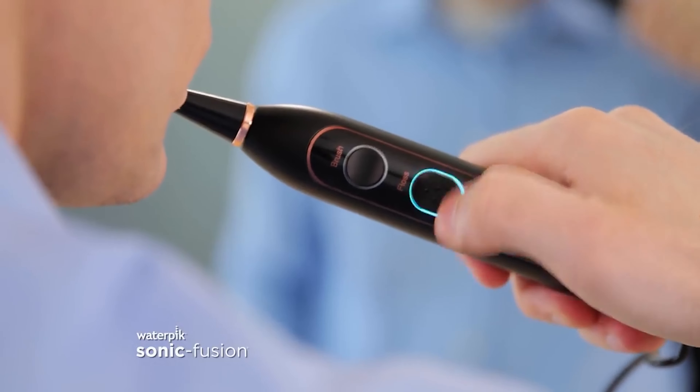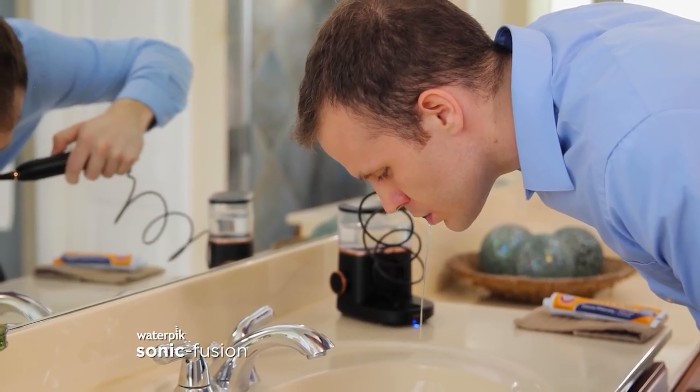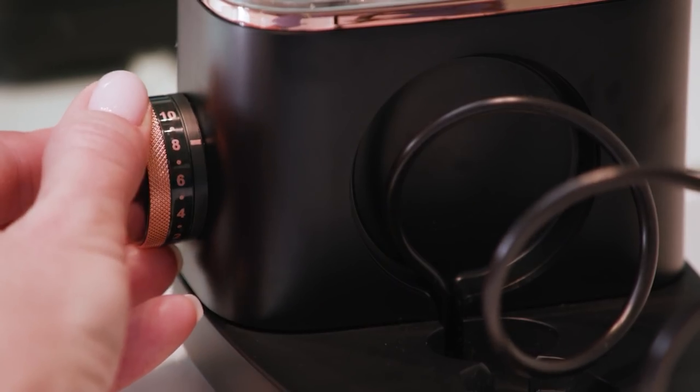Overall, the Waterpik Sonic Fusion is one of the best solutions available if you want the two-in-one combo of cleaning and flossing in one simple-to-use device. Many reviewers commented that the ease of use and ability to floss and clean at the same time improved their level of motivation — they found themselves flossing more regularly and consistently. This is because not only is it much easier, but also because the cleaning effect of using a Waterpik flossing device leaves the teeth feeling extra clean and pleasant after use.